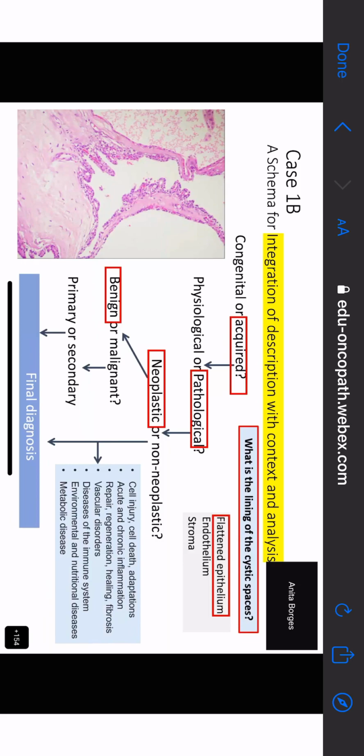Okay? Anything, Vimi, you want to say about its epithelium? It's cuboidal. That's what was said by Diya. Anything else about this epithelium? Is it just merely cuboidal, or do you want to describe those cells? Ma'am, it's cuboidal only, cuboidal cells. All right. Anybody else? Sweta? Eagle eye, can you see anything that you might want to describe those cells as?